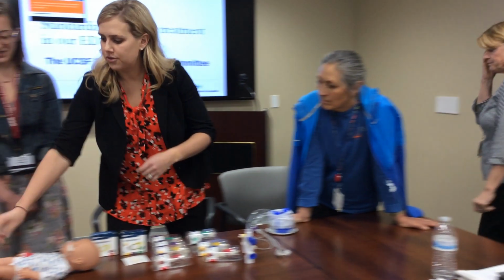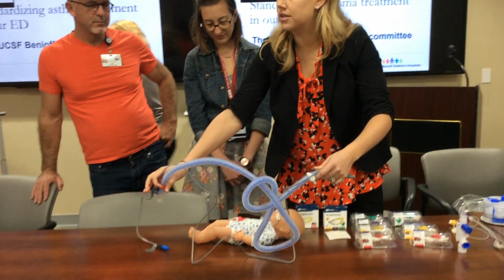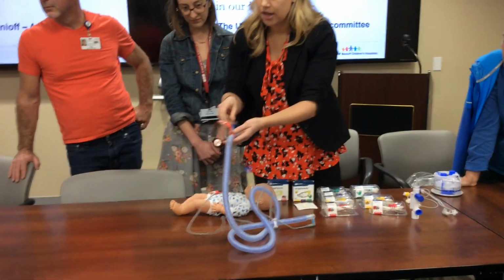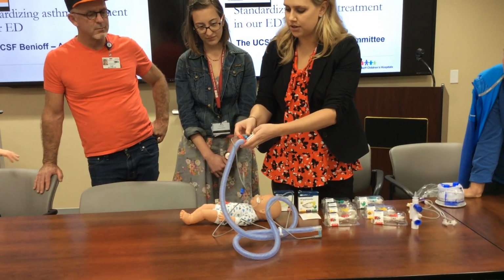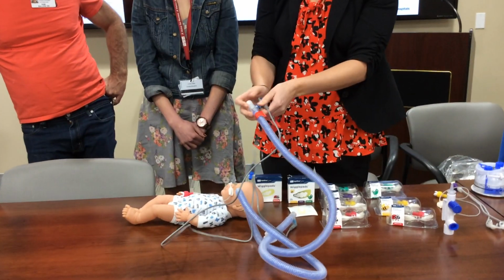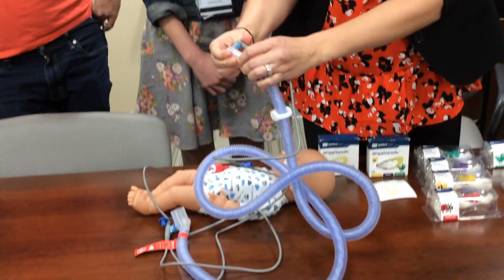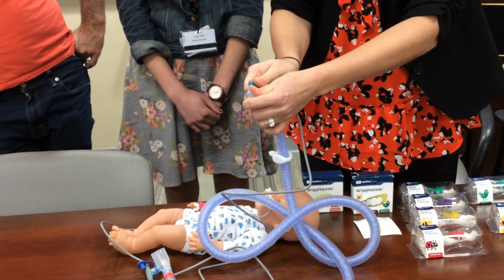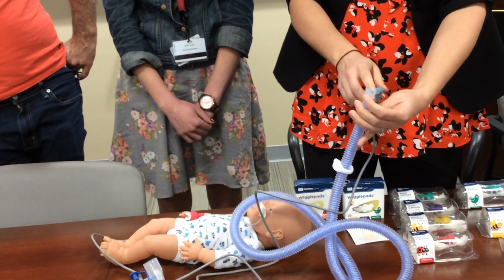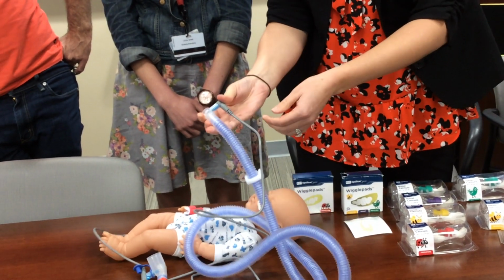Okay, so let me take a look here at the circuit, and you had mentioned some alarms with the temperature. One of the things to look for is to make sure this temperature probe is pushed in all the way. It can be a little difficult towards the end here. If it's not sitting in all the way and there's a cold draft blowing right on that temp probe, sometimes it can drop the temperature. So you really want to push that in there.